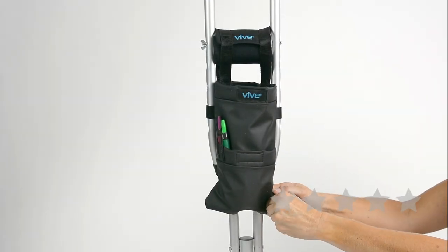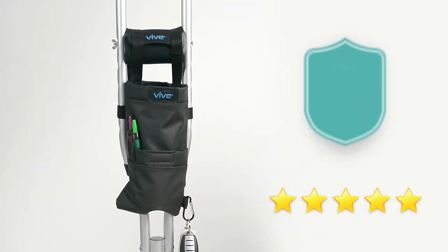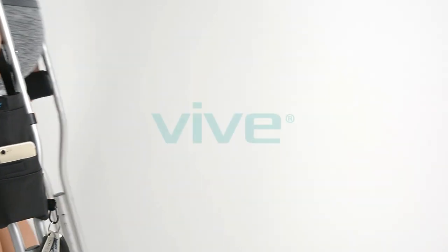The Crutch Bag by Vive is trusted and proven. There are hundreds of 5-star reviews. Plus, it's backed by an unconditional 60-day guarantee. You can't beat that anywhere. So confidently order your bag now for convenient access to your essentials.